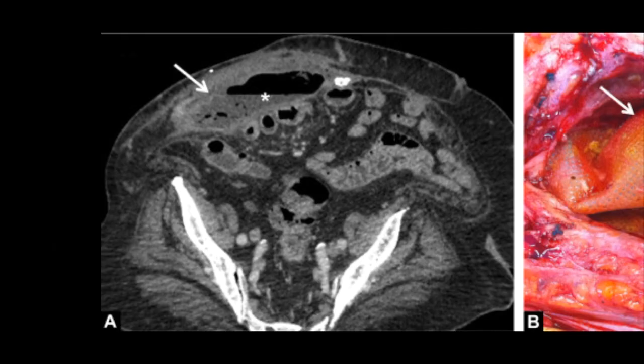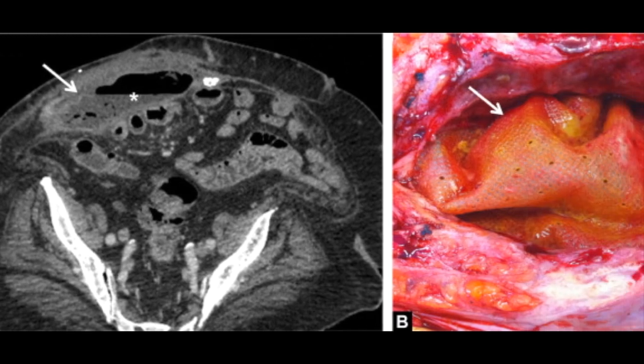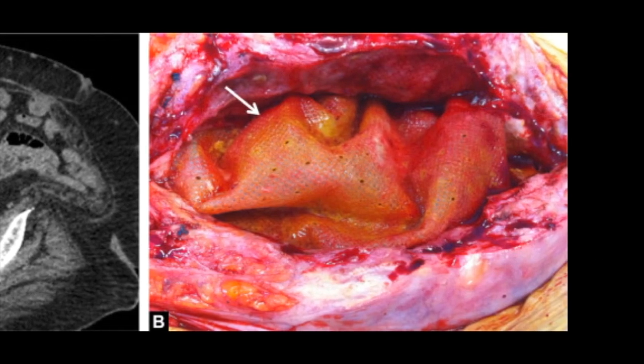Now let's see some complications. This is a post-operative abscess in a patient with septic shock and abdominal pain many months after surgical mesh placement. The image shows a fluid collection in the anterior abdominal wall with a mesh floating inside, indicated by the arrow. Intraoperative images show the mesh in the abscess.